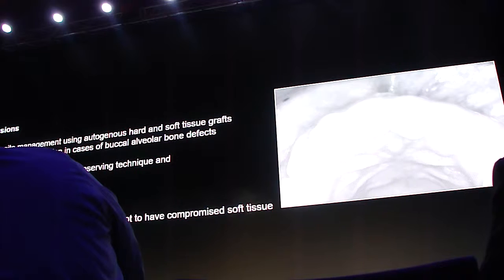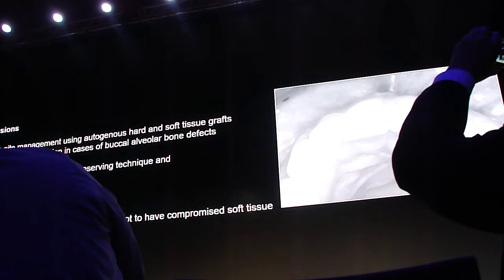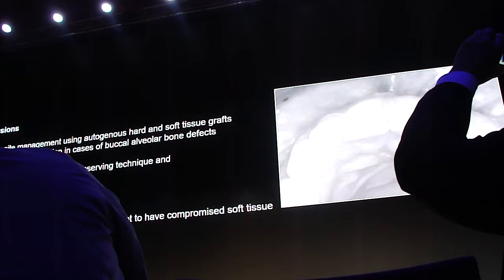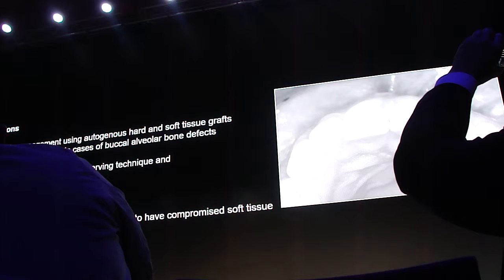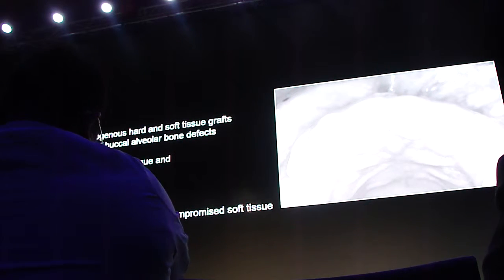By using autogenous hard and soft tissue grafts, we are able to rebuild missing facial bone on the day of tooth extraction, and we are actually able to keep this morphology stable long term.